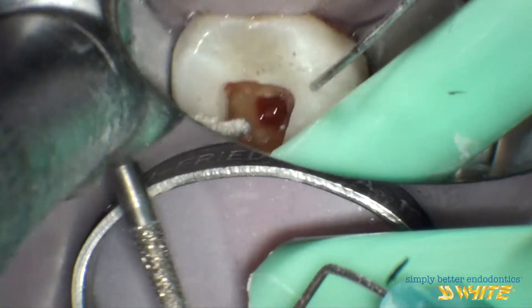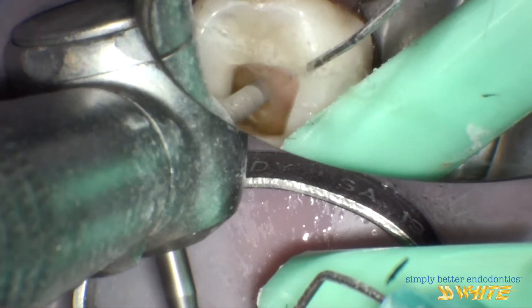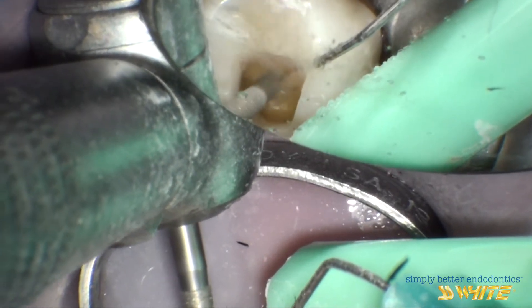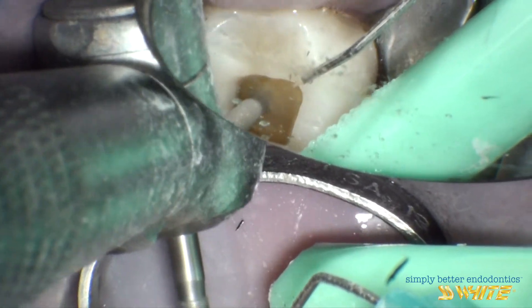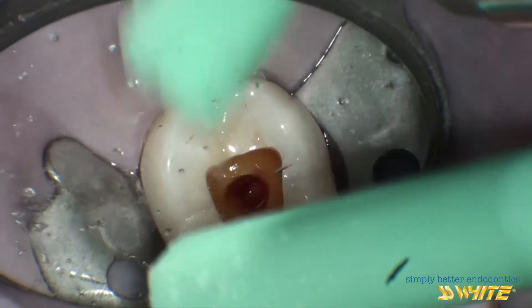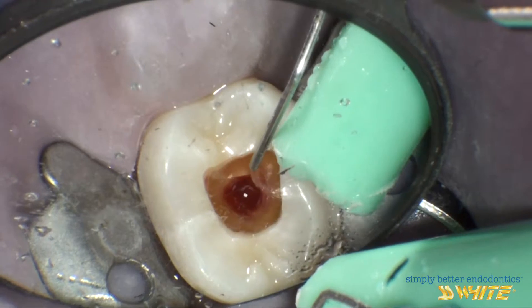This pulp chamber outline is now refined with a smaller tapered diamond so that it matches the access points into the canal system.